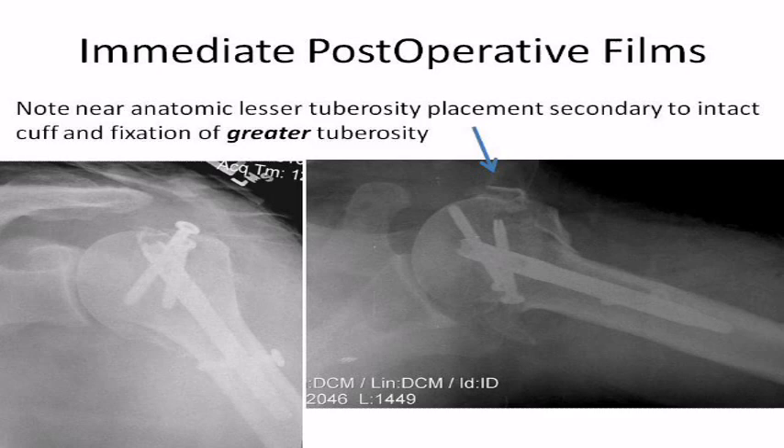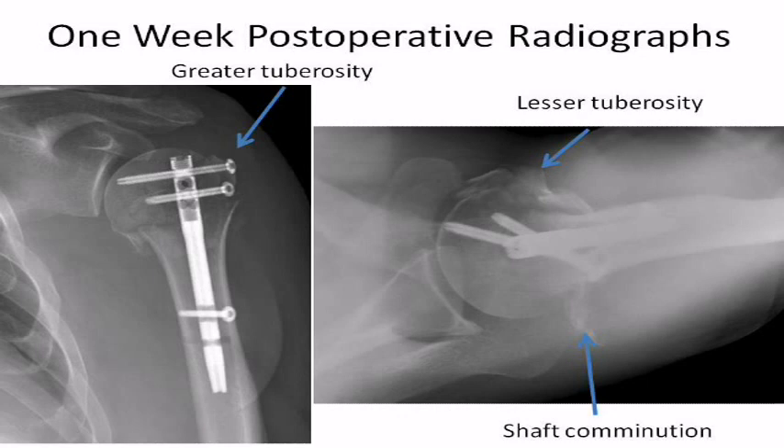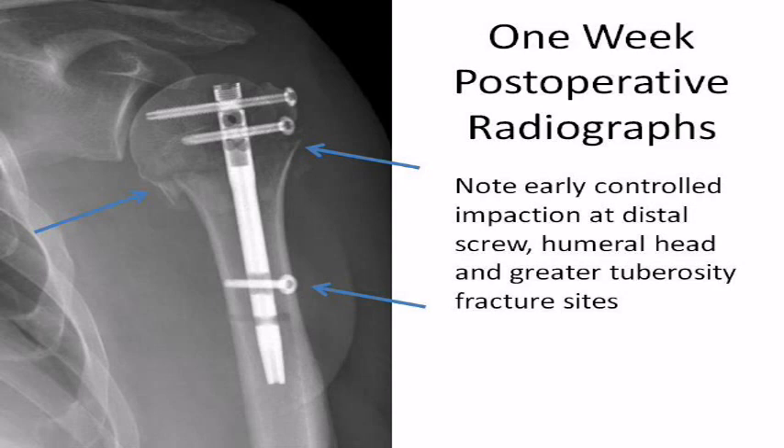Recovery room AP and axillary radiographs reveal near anatomic reduction of the fracture of the humeral head, lesser and greater tuberosities. The one-week post-op radiographs reveal anatomic placement of the tuberosities and humeral head with satisfactory position of the hardware. Upon closer inspection of the one-week post-op radiograph, early dynamic impaction of the surgical neck fracture site is observed. This has been noted by recent literature and many experts to be an important factor in gaining expeditious healing at the surgical neck fracture site.